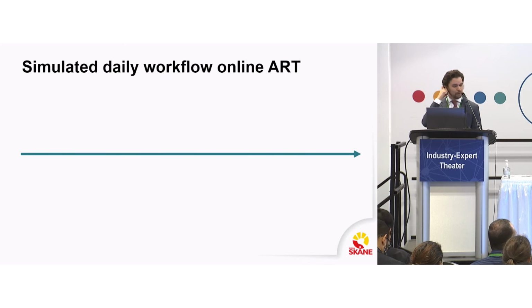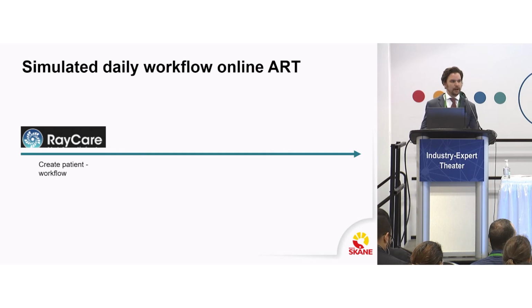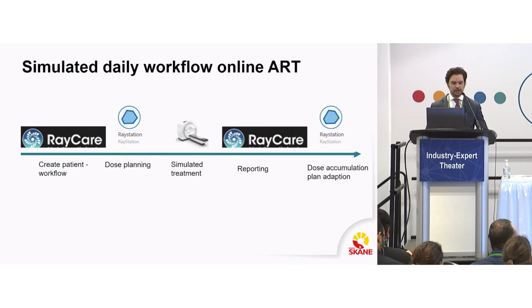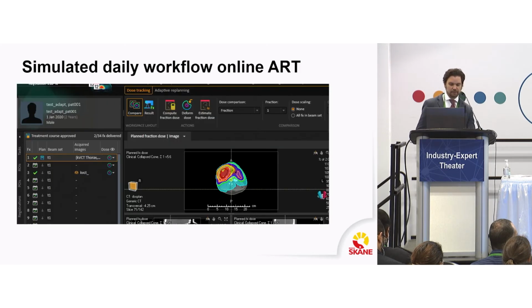Of course, we then simulated the daily workflow with this suite of technology. So we had RayCare where we created the patient and the workflow, did the dose planning in RayStation, simulated the treatment on our standalone PC, and then did reporting back to RayCare. Then you could do dose accumulation and plan adaptation in RayStation. On the other end, it worked great, so it was no problem to do this workflow with the suite of technologies we had at hand.